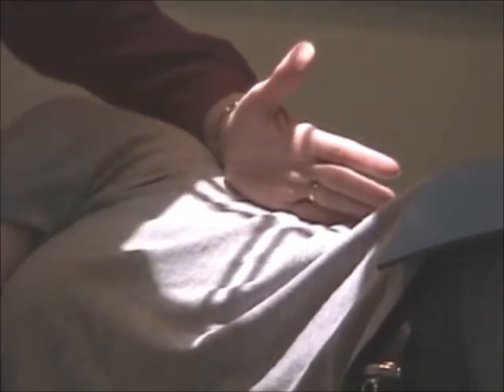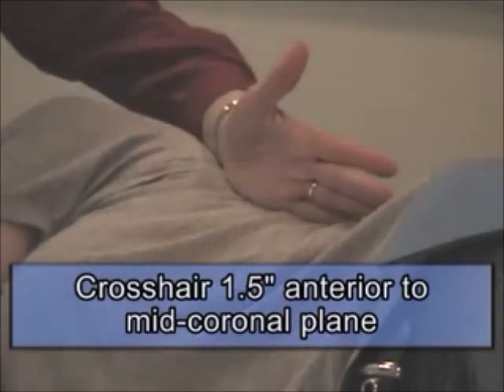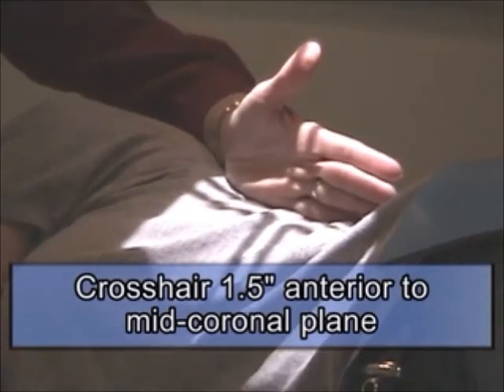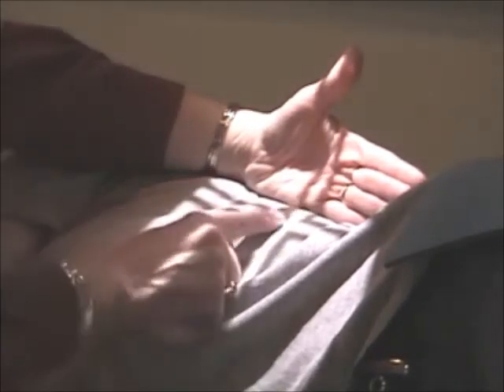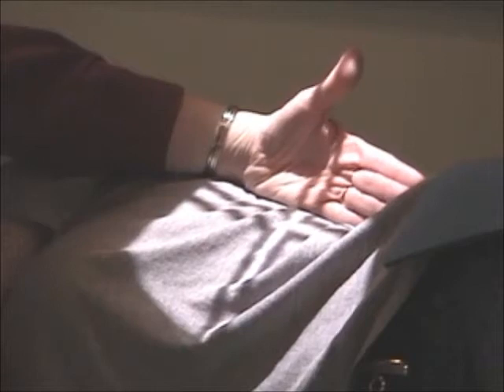And her mid-coronal plane, I'll try to demonstrate it with my hand right here. There's her mid-coronal plane. I'm going to want the crosshair approximately 1.5 inches anterior to the mid-coronal plane. So I'm going to come around and float the tabletop backwards a little bit. Mid-coronal plane, and you want to be 1.5 inches anterior.